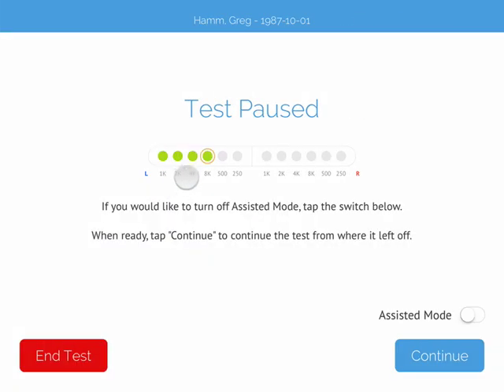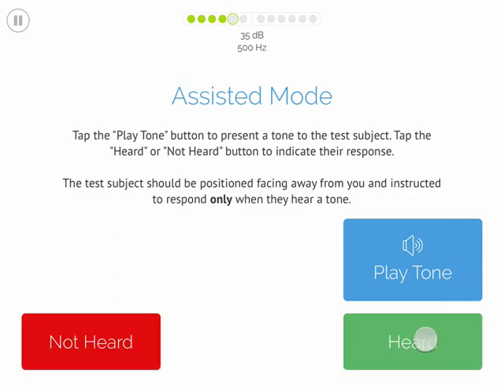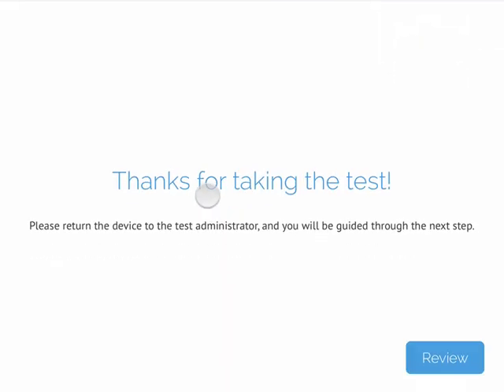You have an option to stop the test, continue the test, or turn on assisted mode. In assisted mode, you present the tone to the test subject and they give you a physical indication of whether or not they heard the tone you presented. For example, they may raise their hand, tap their finger, nod their head, etc.